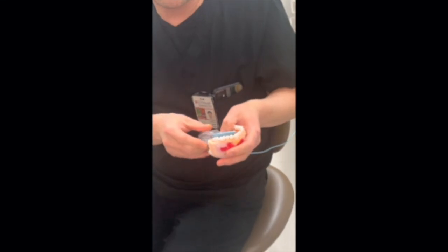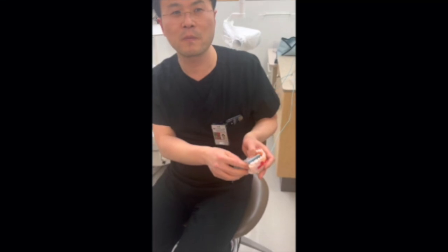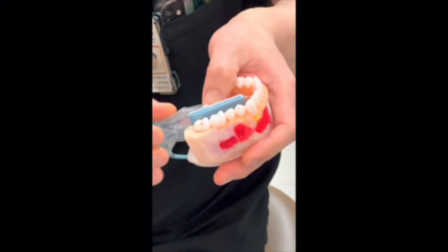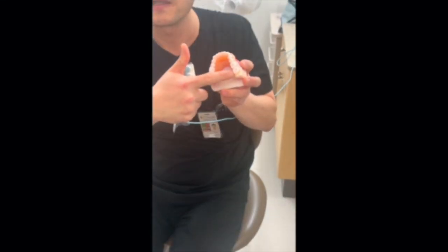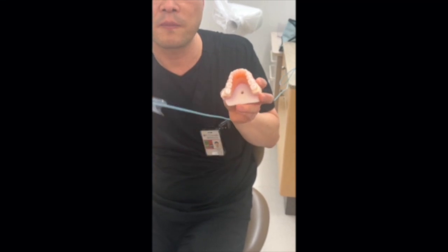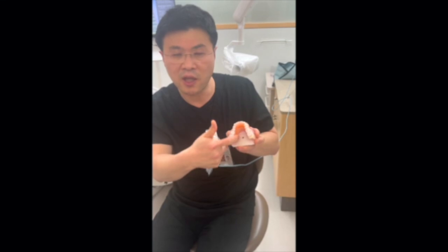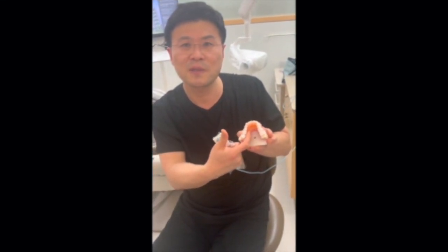Now we're looking at mandibular premolars. It can, again, be very challenging. When you look at the arch, it's much narrower than the maxillary arch. And you also are dealing with the tongue. The lingual tissue is pretty sensitive and can be painful.